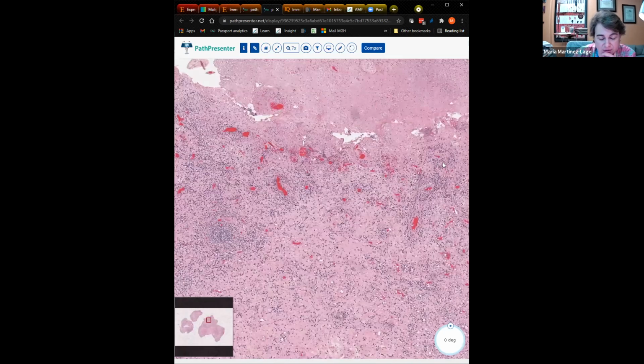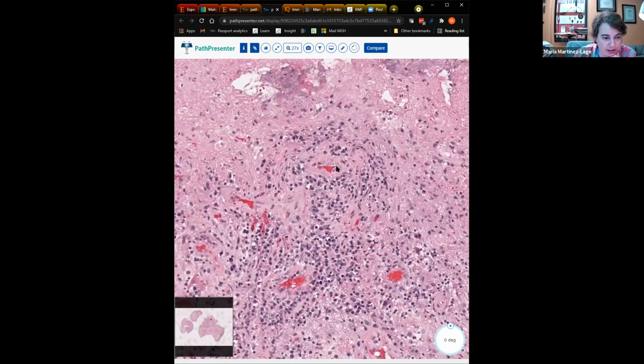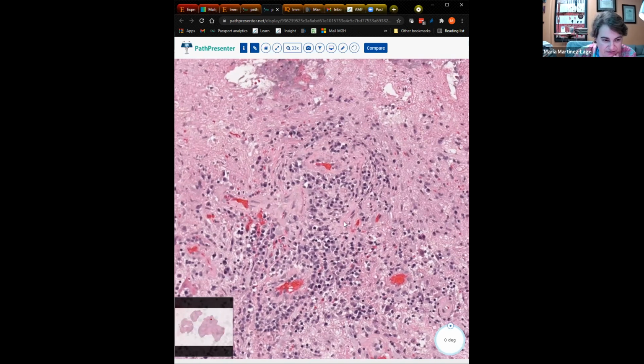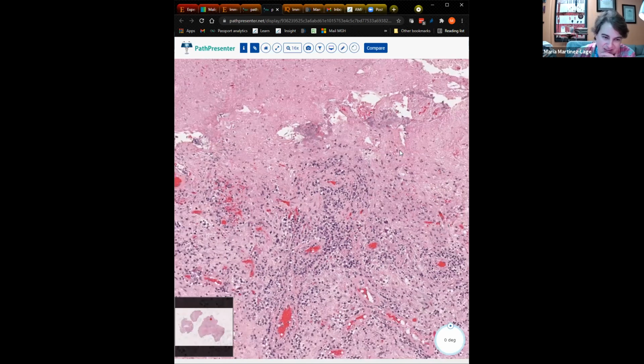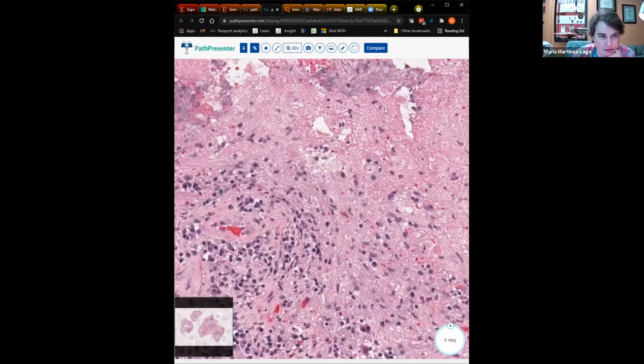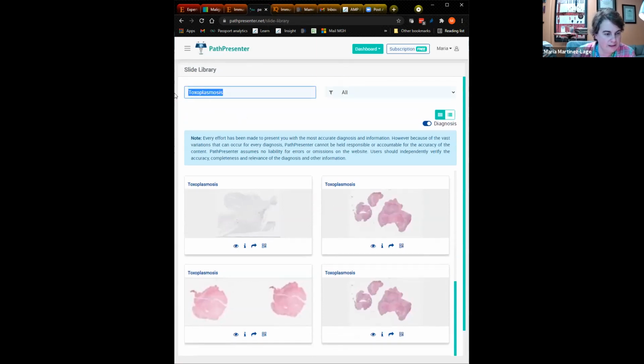We use it relatively generously. So if we have any type of lesion in which we're considering an infection, even if there's not a lot of necrosis, even if the patient is not necessarily immunocompromised, we do look for Toxoplasma. Here's a cystic organisms. All right, so that's it. We can look for other infections, Cryptococcus, for example.